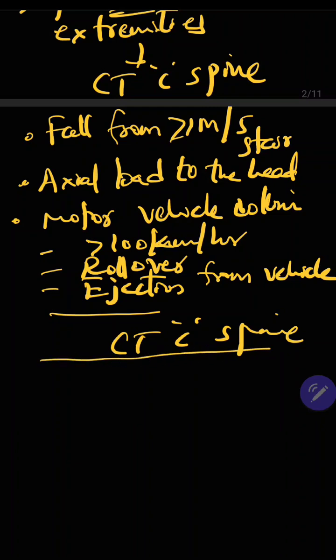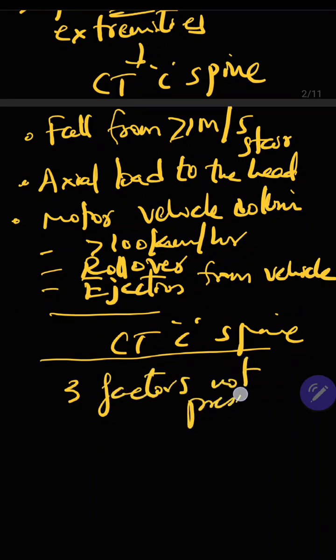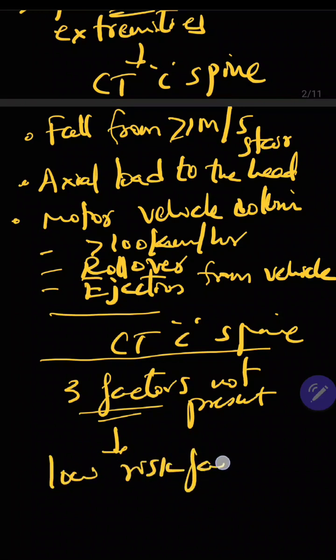And suppose the above factors are not present, so what you have to do? You have to go with another set of factors, which are called low risk factors.